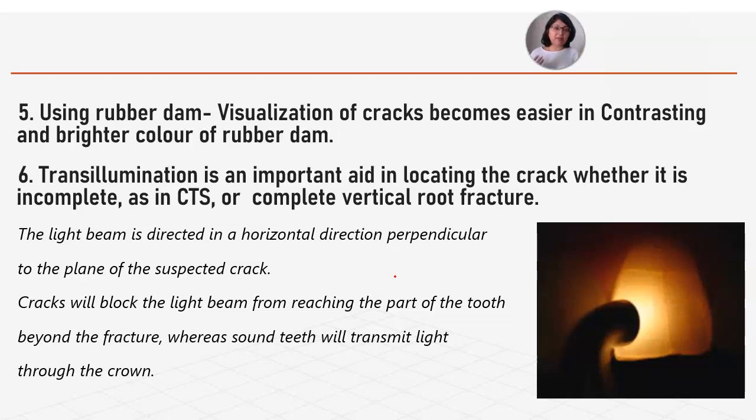Now, I've not done it myself, but I've heard from a lot of endodontist friends that they use it to diagnose, because when you put a rubber dam against a particular tooth and you're removing the old filling, or you are actually trying to follow the crack line, because of the contrast, because rubber dam could be bright blue in color or a dull green in color. When you isolate the tooth, the contrast in the colors can actually show you the crack very clearly. Again, I've not done this till now to determine the crack line, but if you want to try this, I've heard that this is a very good diagnostic test too.